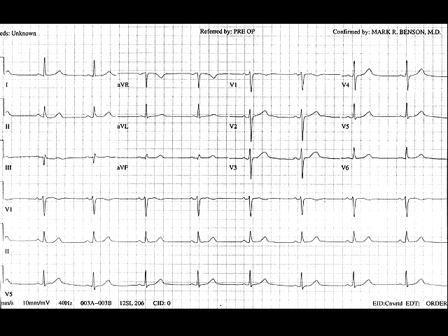This tells you that atrial depolarization originates high in the right atrium, in the sinus node, and travels in a downward direction towards the feet. The QRS axis is normal, upright in leads one and two. The intervals are normal.